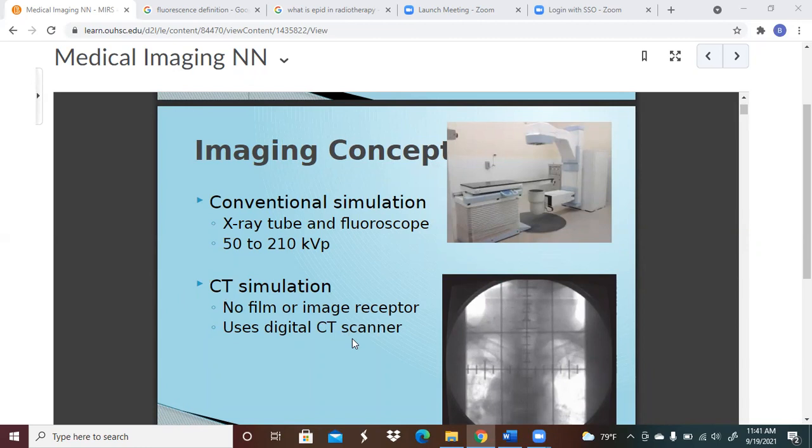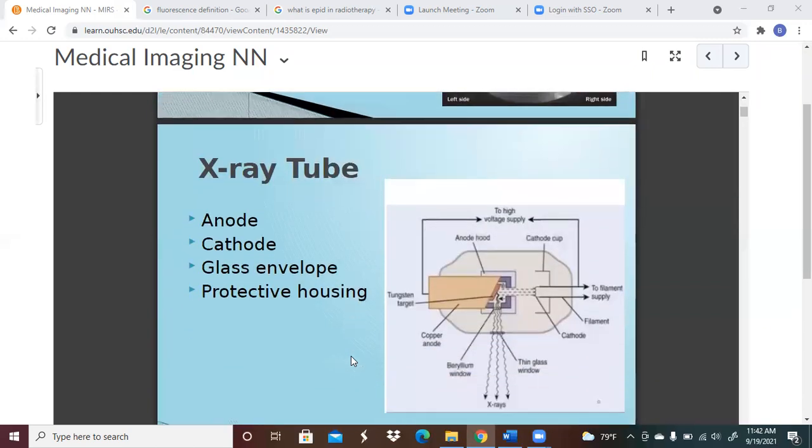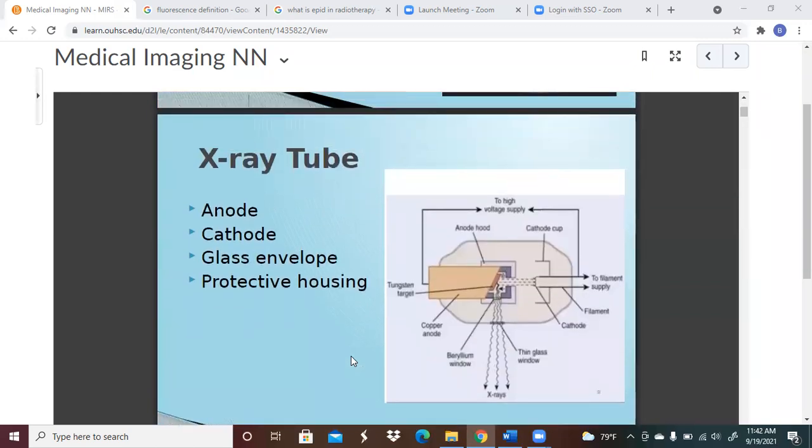Sure. But the capacity that you have with CT simulation, being able to mark on a patient and send all of that information to dosimetry so that they can start planning, being able to take several images, not only that, but being able to gate, take a gating scan on somebody. These are the reasons why a lot of the older technology is being replaced. It's just the newer technology allows you so much more information. This information you will be able to find in chapter 3.